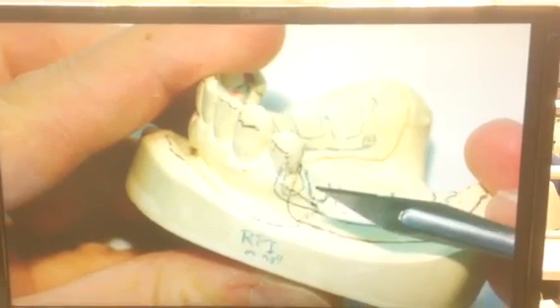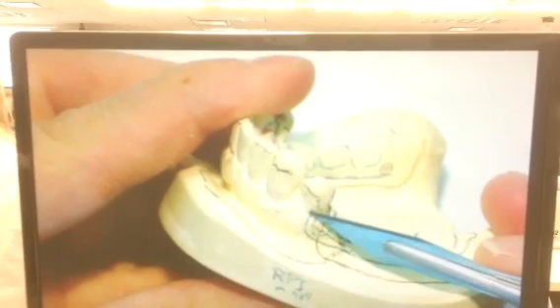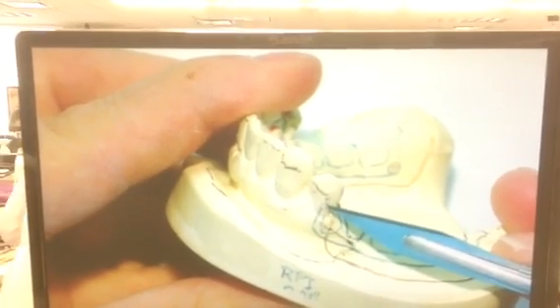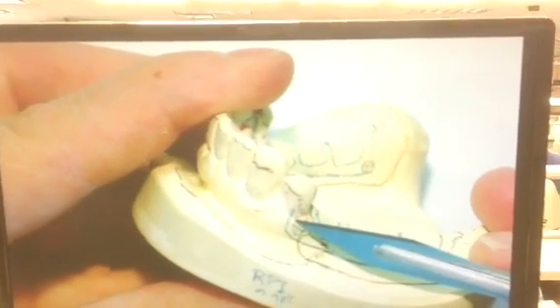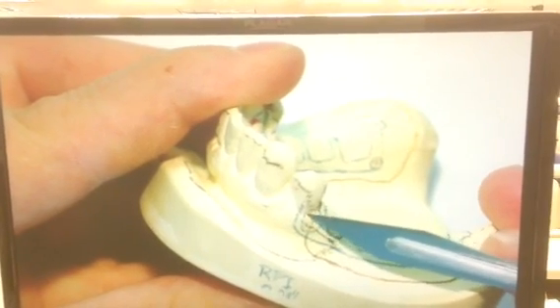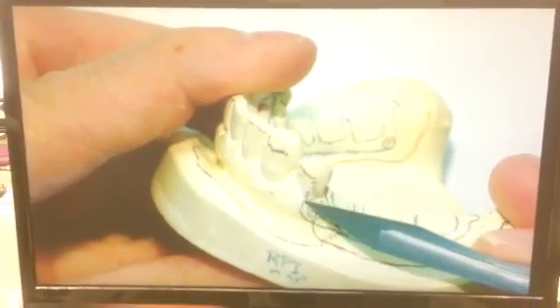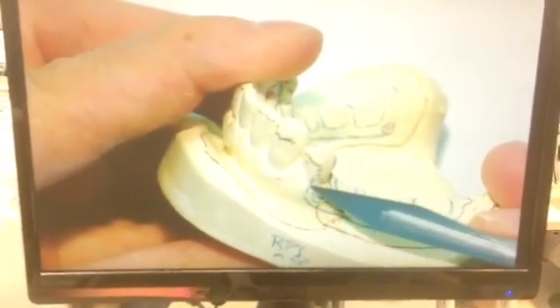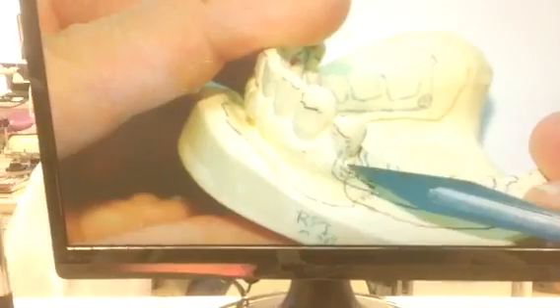or slightly mesial. I-bar encircles your undercut mark. It goes up and touches the height of contour and comes back down. Remember, this window that is formed right here needs to be 3 by 3 to keep from pinching that tissue. If not, drop your I-bar down a little bit further, or if you absolutely have to, he's okay with you working this portion of it just a little bit mesial to open up that window.